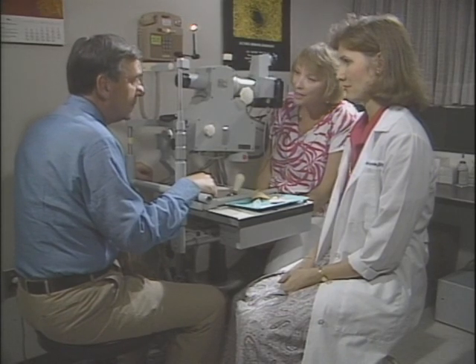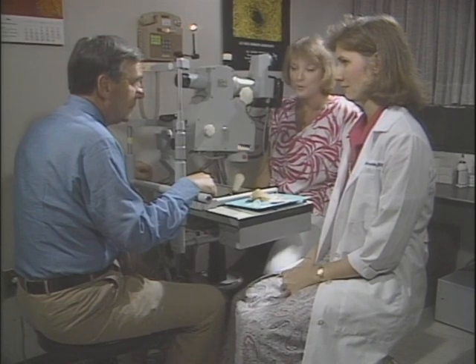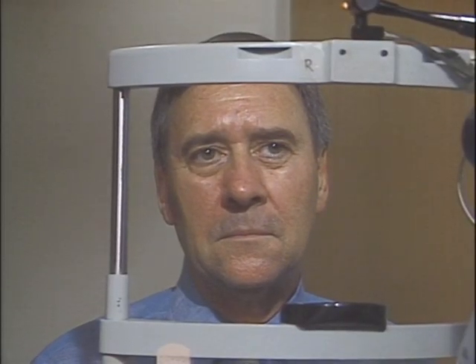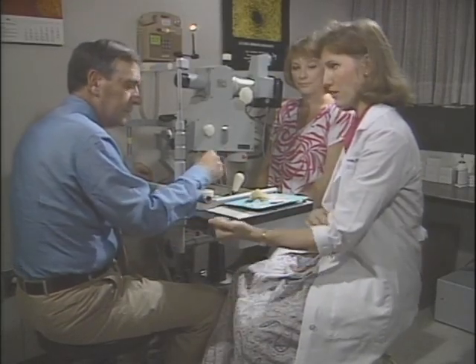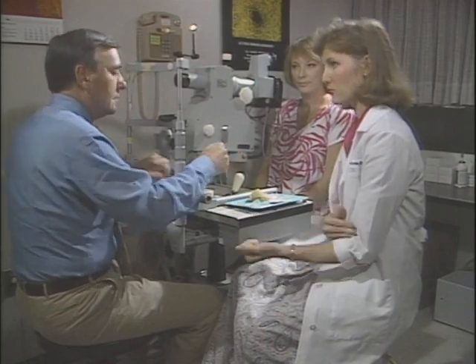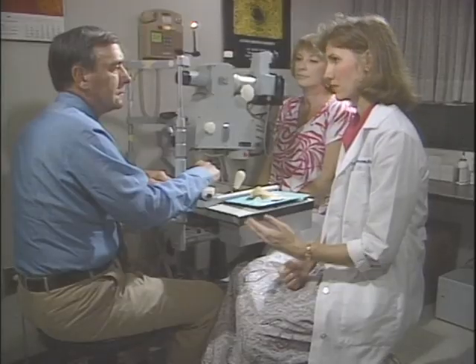My name is Judy Belt. I'm going to be your photographer today. You're going to have a fluorescein angiogram. Your doctor may advise that you not eat anything prior to the angiography exam. In order to obtain the best photographs, you will be given eye drops prior to the exam to dilate your pupils. This will cause some blurriness in your vision for several hours. It's important that you keep your chin all the way forward in the chin rest.